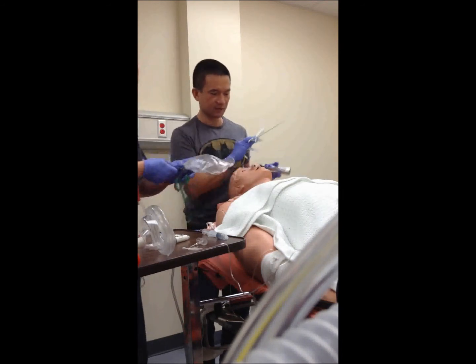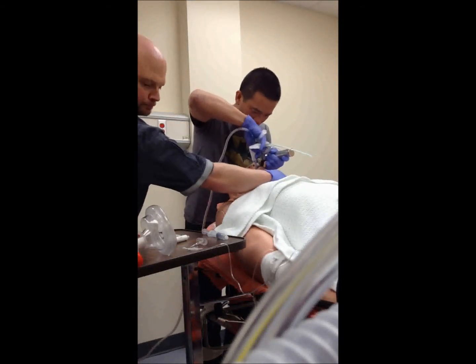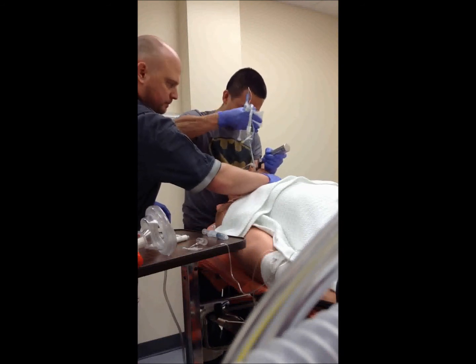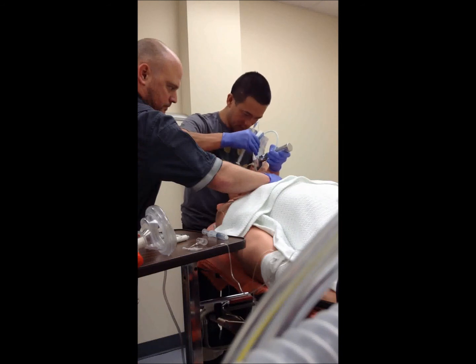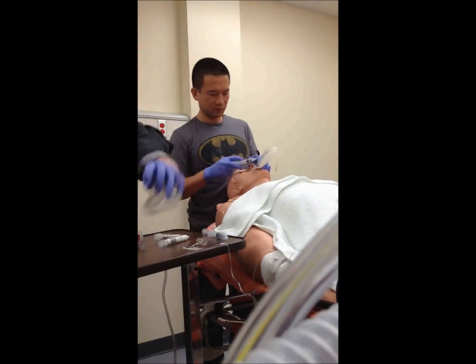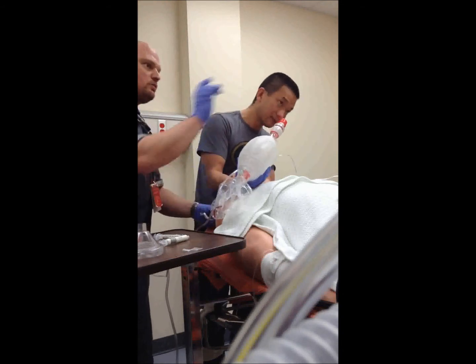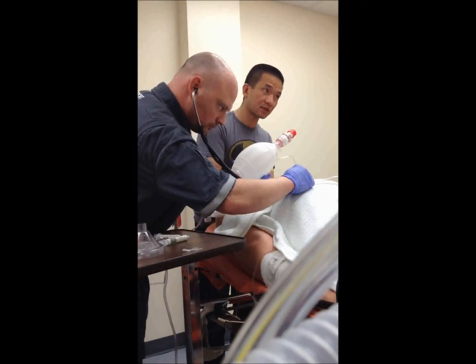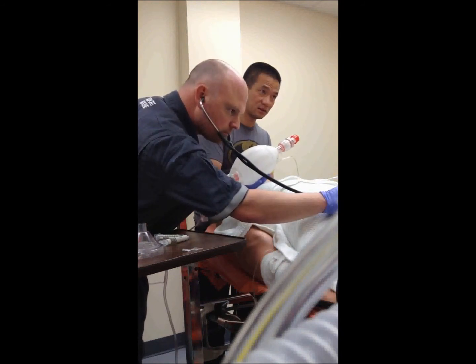45 seconds — removing the mask, making sure they're fully relaxed. A little bit of suction here. Get ready for ELM if required. I've got a view — I can see the cords, passing the tube right now. Okay, you're going to bag and secure the tube. We've got end-tidal CO2 — cycle the blood pressure again please. Good air entry, good waveform, good sats, good end-tidal CO2.